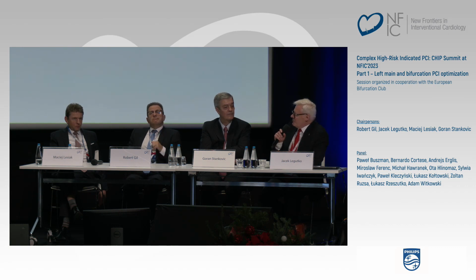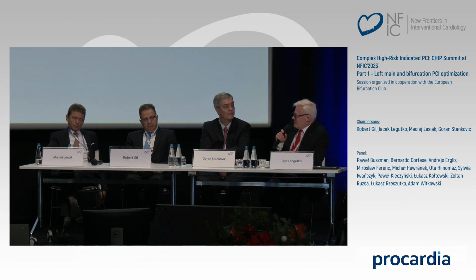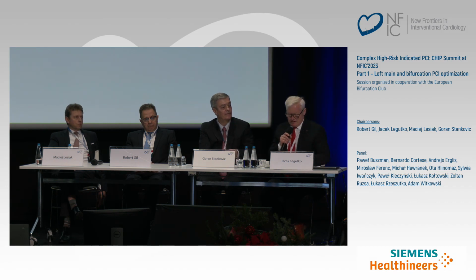This is first. Cutting is very effective, but for superficial calcium. And the IVL is the only one which can also modify deep calcification. So this is why we try to use this more and more often. We know the limitations, economical limitations, but I am really sure that in the future they will be somehow overcome, and we will use more and more of this technology, which is very easy to use without a learning curve and very effective.